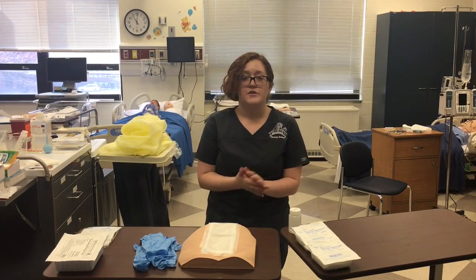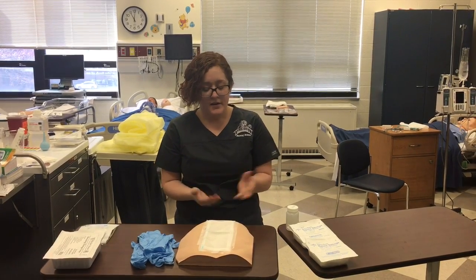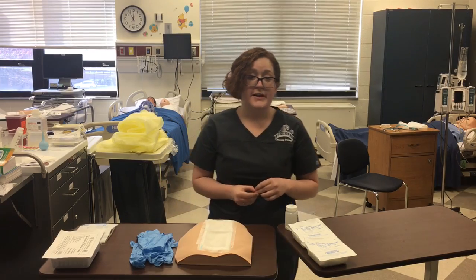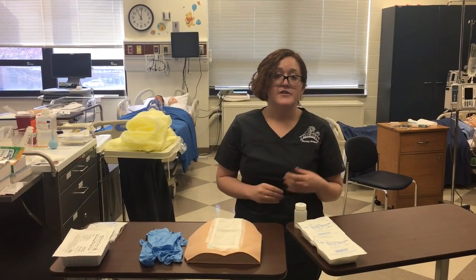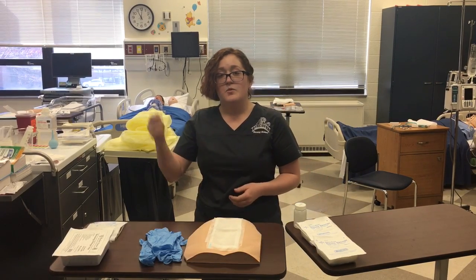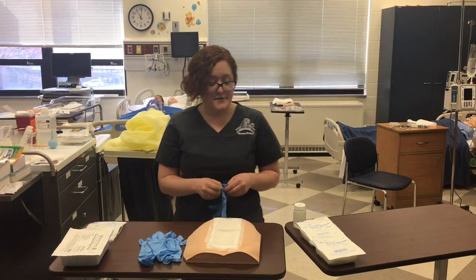Alright, then I'm going to enter the room. I'm going to perform hand hygiene and introduce myself to the patient. I'm going to explain the procedure that they're going to be doing, and I'm also going to identify the patient using 2 different identifiers, name and date of birth. After all of that's done, I'm going to provide privacy, and then I'm going to apply my clean gloves.